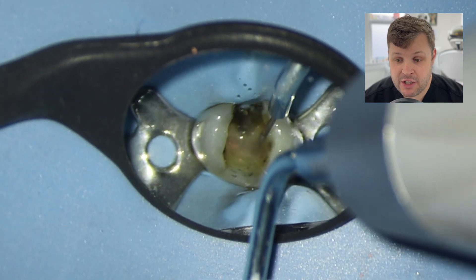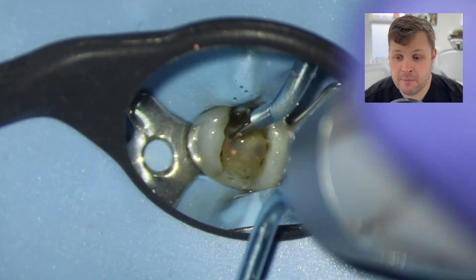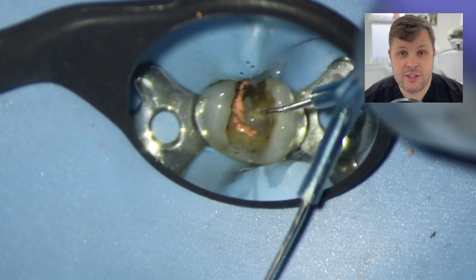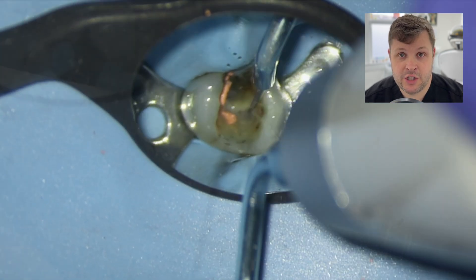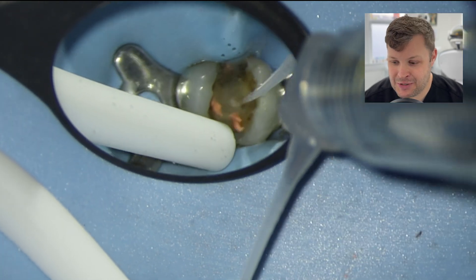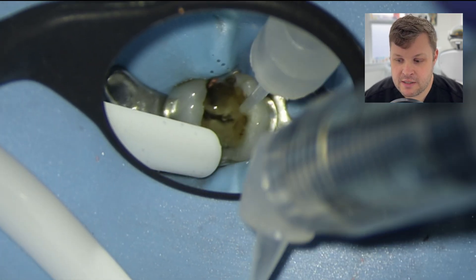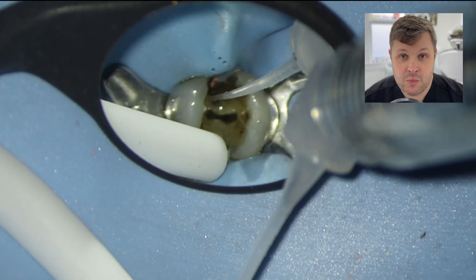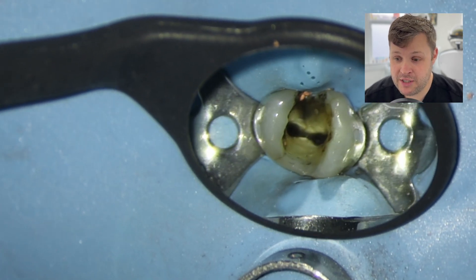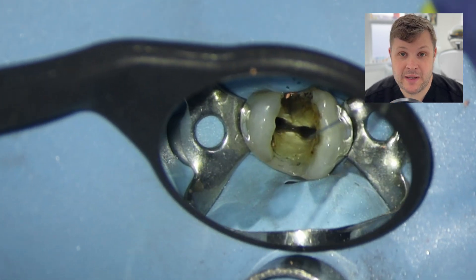I like to use a lot of ultrasonic activation — this removes all the little GP fragments from the canal space, and sometimes when you directly touch the ultrasonic tip onto the GP it vibrates it out of the canal. Lots and lots of irrigant also helps cool the instruments so they're less likely to break under pressure. The canal spaces now look relatively clean.